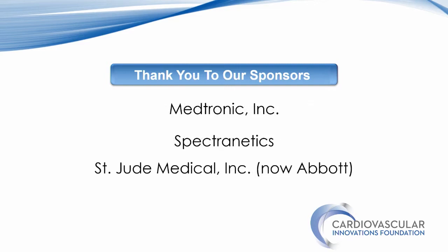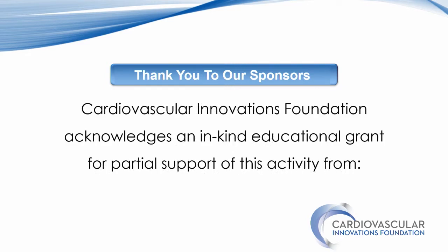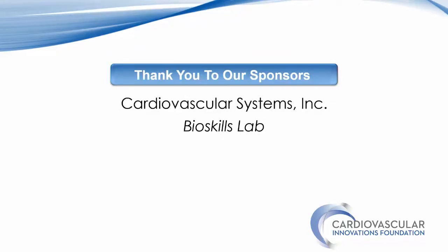So just the fact that one of them was blinded, one wasn't, I think is important. The amount of stenting, I think, is important. That's why I think real-world data is also very helpful in making these decisions. And also, I think that there is the design of these studies. In one trial, they undersized because they were trying to avoid dissection. In the other study, they try to oppose the vessel wall. So also the design of the studies becomes important.